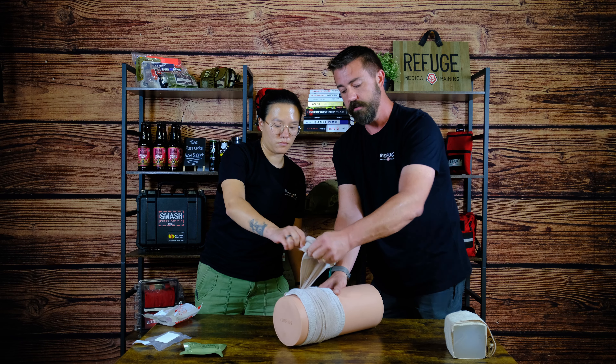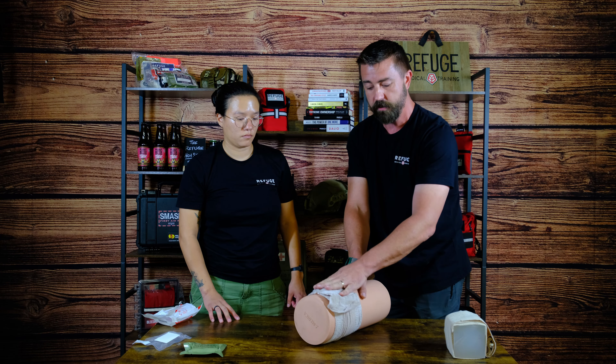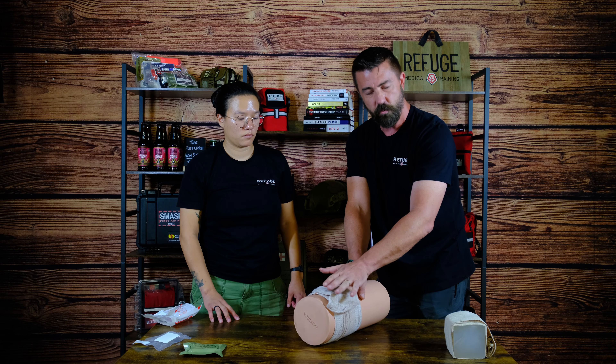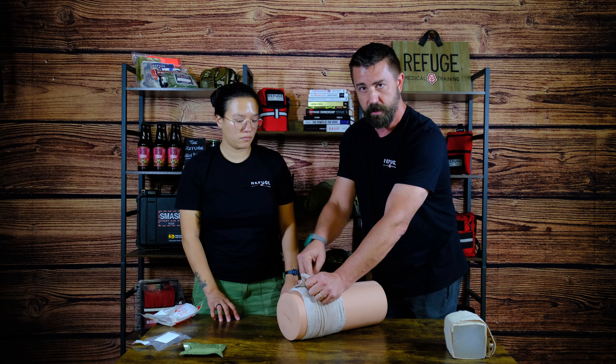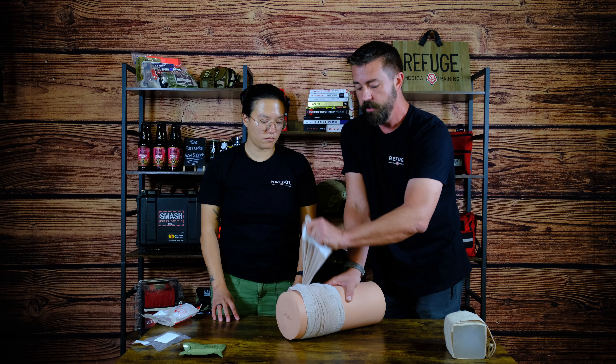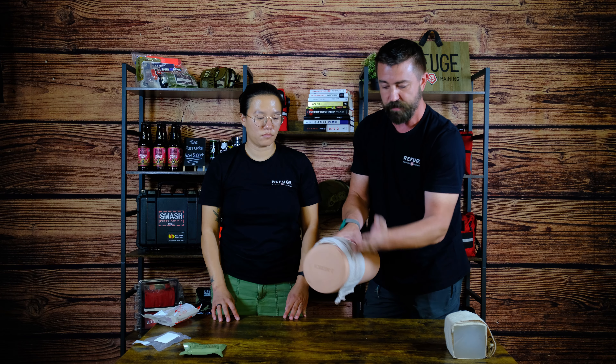When you secure this, you don't want it on top of the side of the injury, because physics being what it is, it will gradually lift pressure off that injury. We want to maintain pressure on top of that injury, so pull it past it — ideally 90 degrees past the side of the injury.